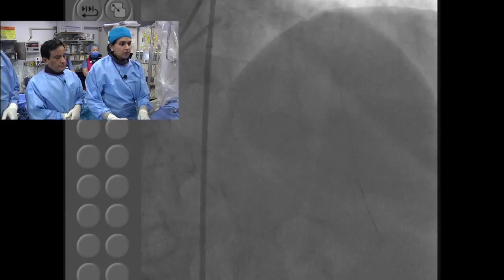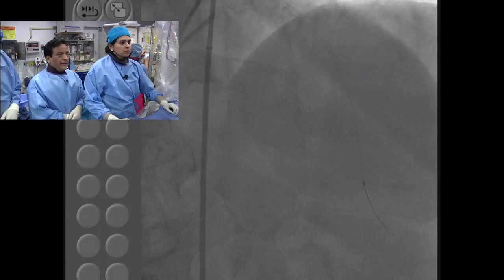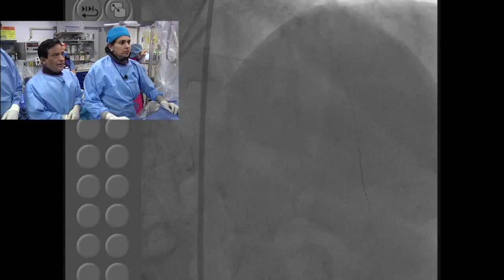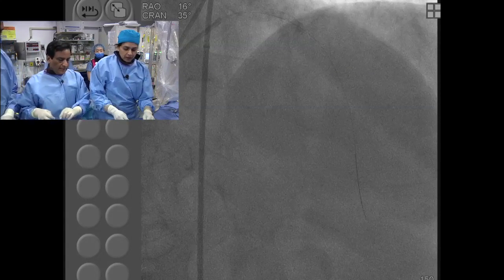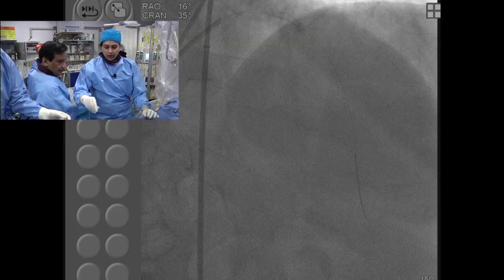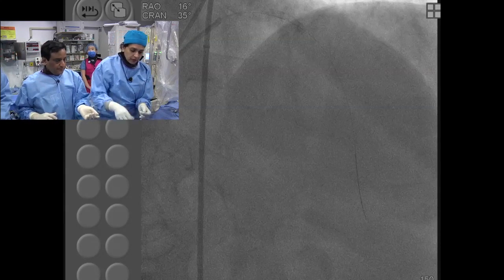What's the status of the anticoagulation at the moment? Now we can restart. I know people believe that ACT does not matter with bivalirudin, but I can tell you, once your ACT is 400-500, you start seeing these clouds. We stop it for a few minutes. We saw that little cloud when we were at that septal. Usually with Angiomax, you don't have to worry. You just stop it a little bit, and it has disappeared now. Excellent.